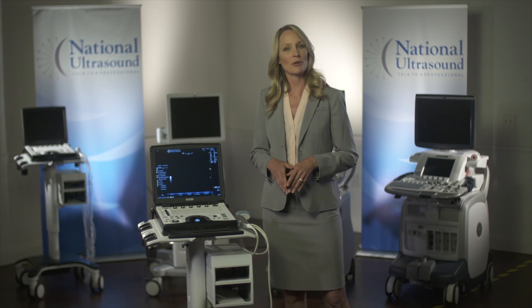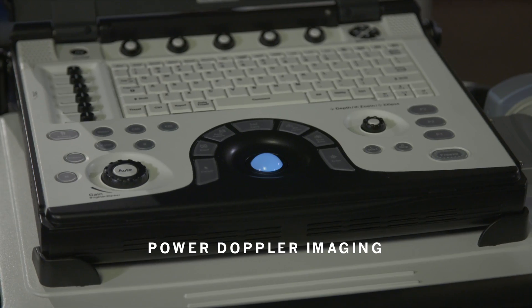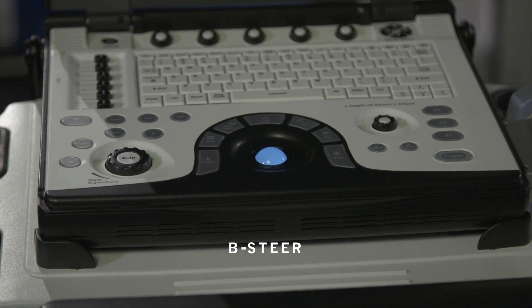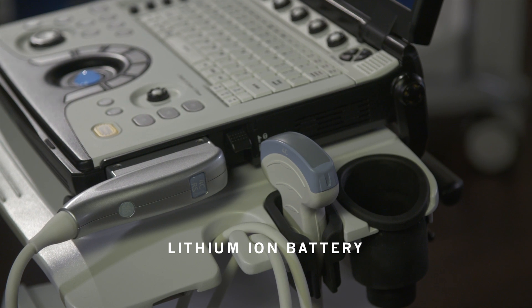The system has many great features including a 15-inch high resolution color LCD, accurate anatomy with power Doppler imaging, B-SEER plus needle recognition, and a standard lithium-ion battery with up to an hour of scanning time.